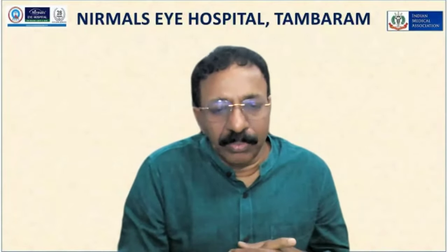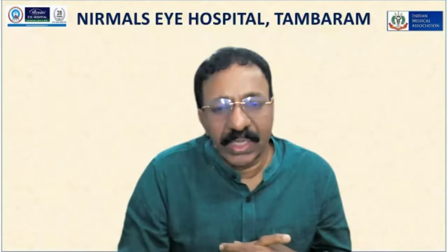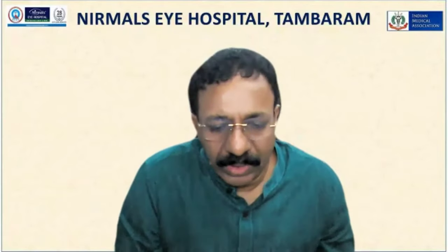At the outset, I would like to thank Senthil for giving me this opportunity, and Dr. Ravindra for this question. First of all, it's a hypothetical scenario, and hypothetical scenarios are better answered with the standards in place. First, I would see the infrastructure where the autoclave is placed, and whether the process goes on as per the standard operating procedures. The second point you are asking is about S-class. So many things have been spoken about S-class and B-class, and about the fear of unsterilized hollow equipment in S-class.